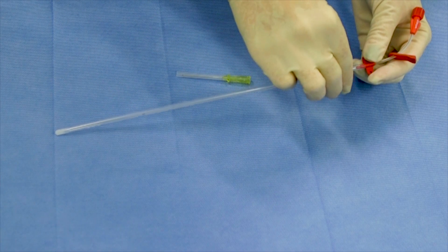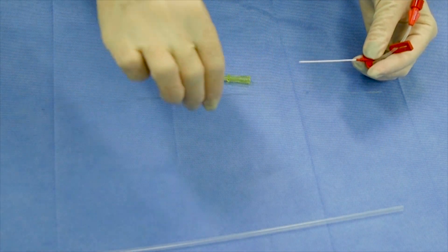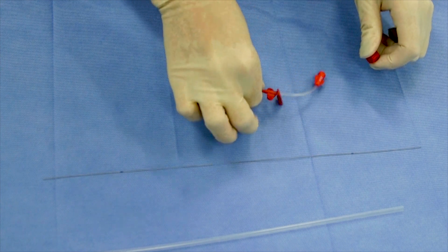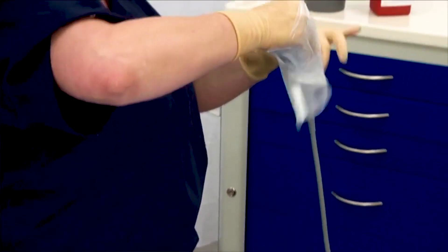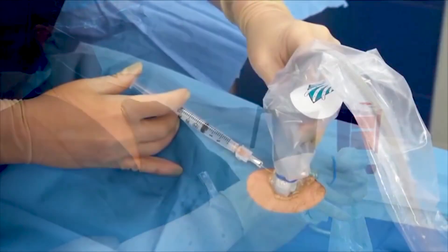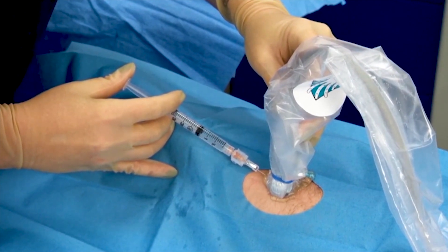Now we will review the catheter prior to insertion. Remove the protective shield from the catheter. Remove wire and cap from extension tubing. Next, don sterile probe cover using sterile technique. Once covered, the probe needs to be maintained on a sterile field. Administer local anesthetic when indicated, and use the ultrasound when available to visualize infiltration of local anesthetic at the intended insertion location.